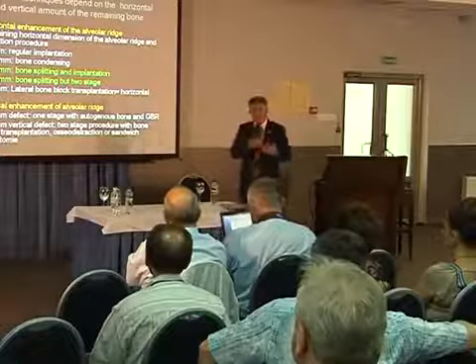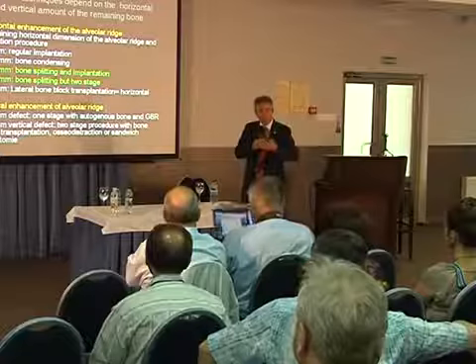Is it 5 to 6 mm implantation with bone condensing?